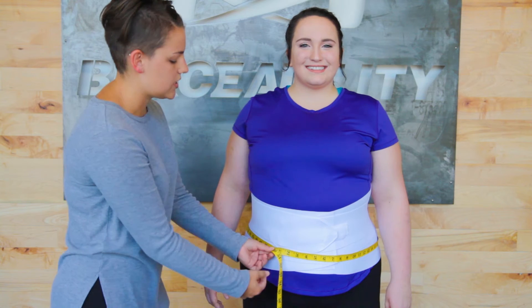Her body circumference is 50 inches. Once you've established your body circumference, you are ready to select your size.